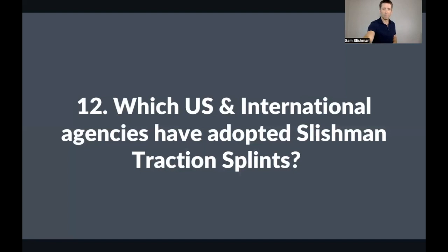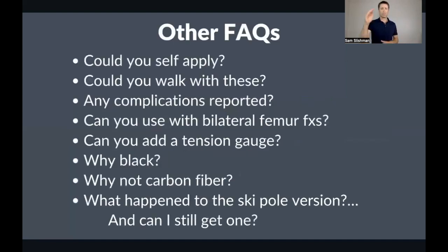All right, other FAQs, I'll go through these quickly. Could I self-apply it? Obviously, yes. Could I walk with these? If I don't have a femur fracture, I can fully weight it. But with a femur fracture, pretty hard.